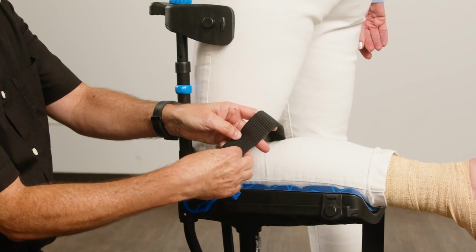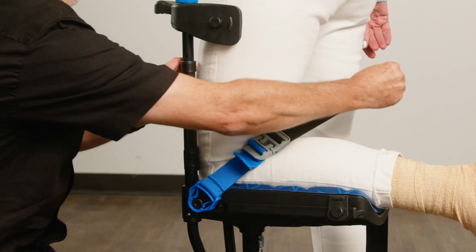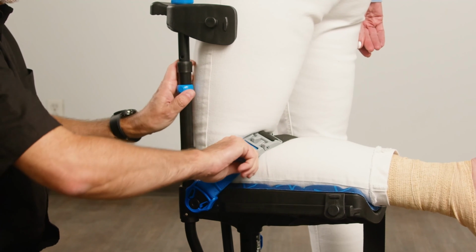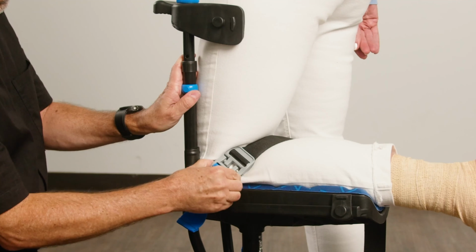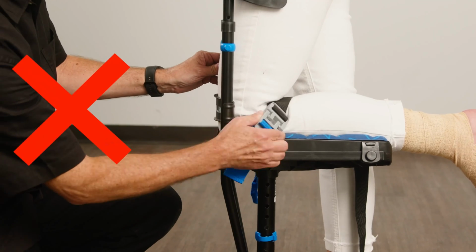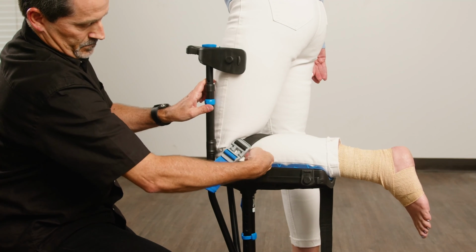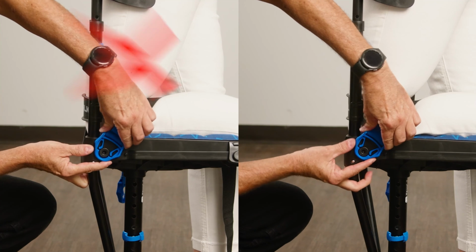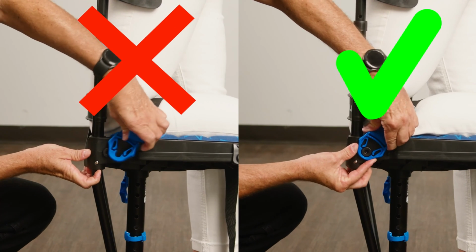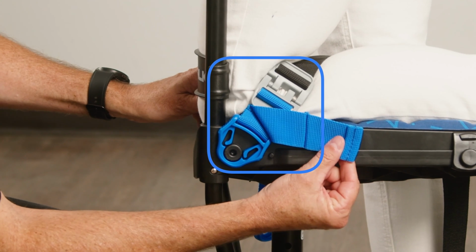Reaching behind the patient's knee, pull on the tail of the black webbing until the strap is snug. Then cinch it to full tension by pulling on the blue section. Then test to ensure it's fully tightened. If the strap is properly tensioned, it should be very difficult to slip your finger between the strap and the patient's leg. And it should be impossible to remove the blue buckle. And when properly tensioned, the gray buckle should be almost touching the blue buckle.